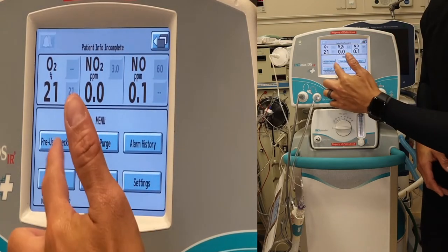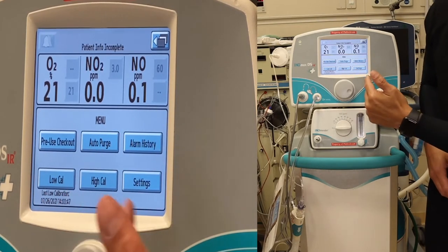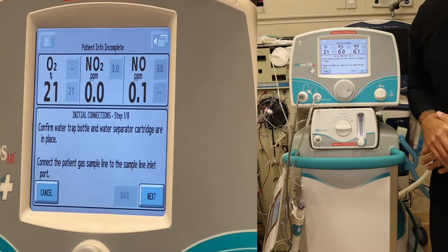In this menu you'll see a pre-use check, auto purge, alarm history, low cal, high cal, and settings. We are going to do the pre-use checkout. Go ahead and press that and we're going to go through the initial connections.